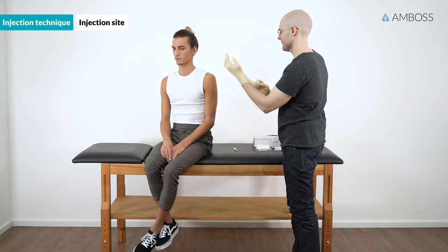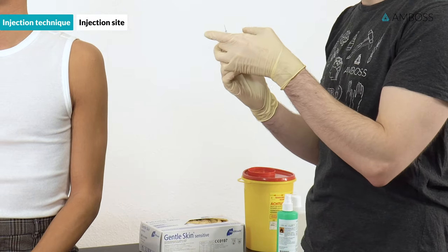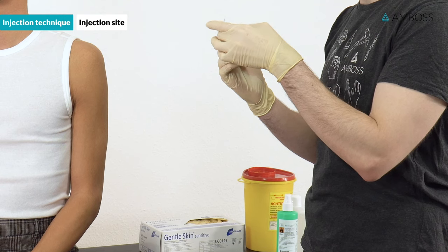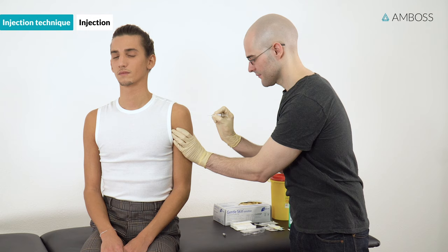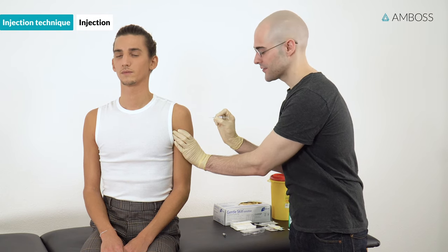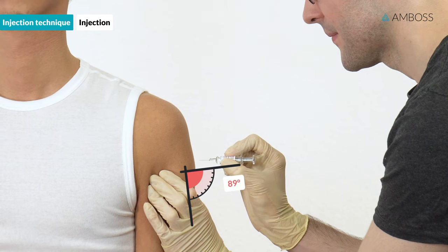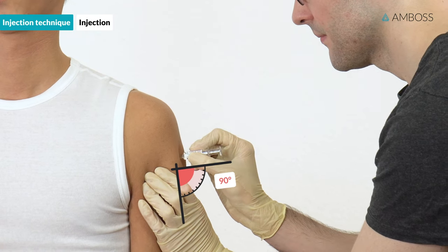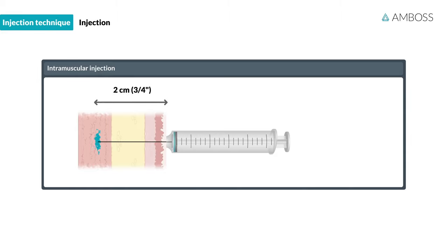Put on gloves while waiting for the site to dry. Remove the cap and expel larger air bubbles from the syringe; small amounts of residual air do not pose a risk to the patient. Hold the deltoid muscle with your non-dominant hand without lifting the subcutaneous tissue. Hold the syringe between thumb and forefinger, roughly like a dart. Encourage the patient to distract themselves from the pain by coughing or holding their breath. Quickly pierce the skin perpendicular to the surface; the standard puncture depth is about 2 cm (3/4 of an inch), but this should be adapted to the thickness of adipose tissue.